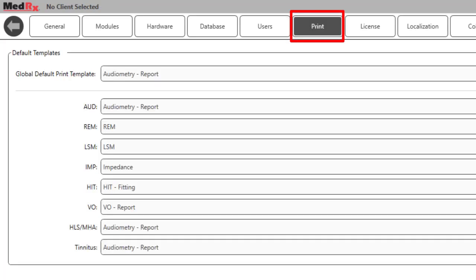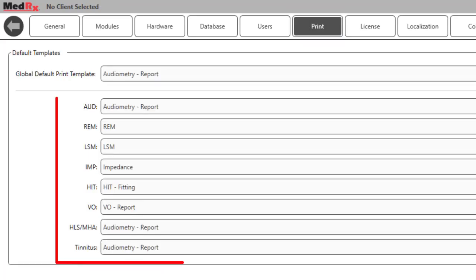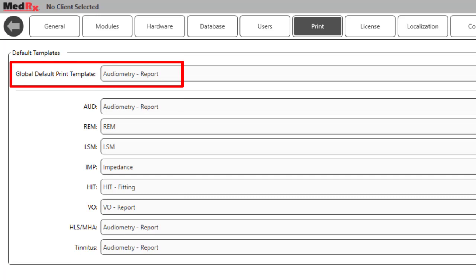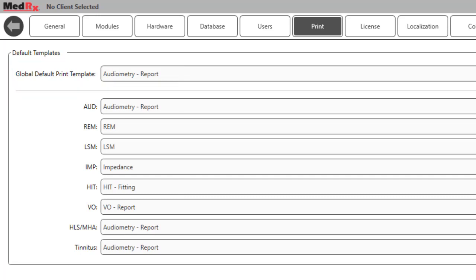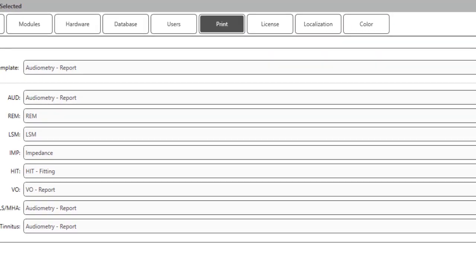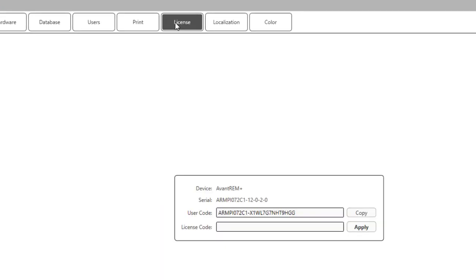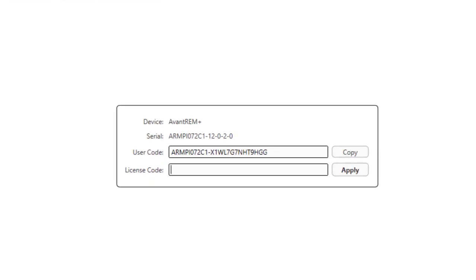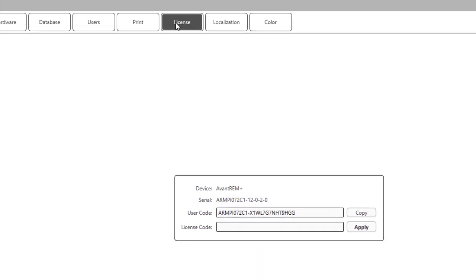The Print tab allows users to assign default print templates by module and a default Studio Global template. The templates assigned will print when the Direct Print button is clicked. The License tab will show your device hardware, serial number, and Studio user code. This tab may be used when adding new modules to your Studio software.